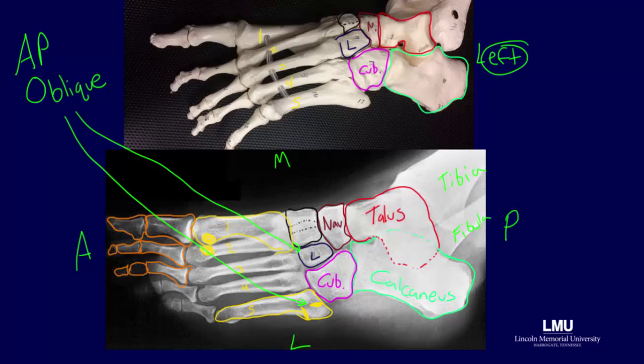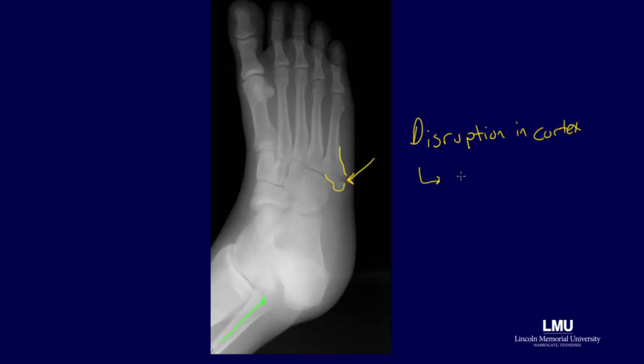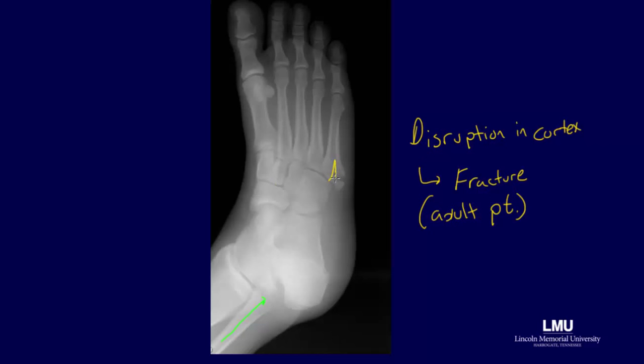Applying our systematic approach to this radiograph — starting proximally and proceeding distally — when we get to the tuberosity of the fifth metatarsal, we see a definite disruption in the cortex of the bone. This disruption is consistent with a Jones fracture in that it is transverse to the plane of the long bone. Since this is an adult patient, a Jones fracture is the most likely diagnosis. If instead this radiograph showed a disruption in the cortex of a child, we might suspect cartilage that has not yet calcified — and therefore this would not be a fracture but an apophysis.